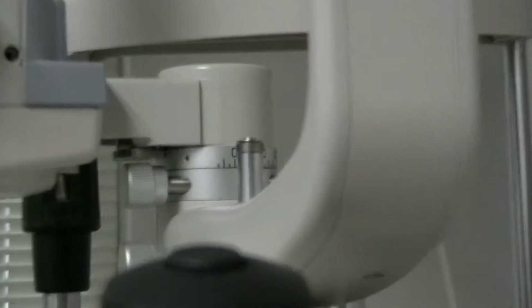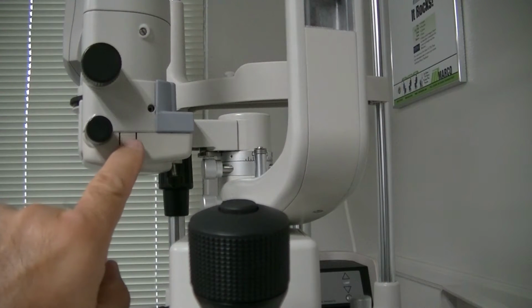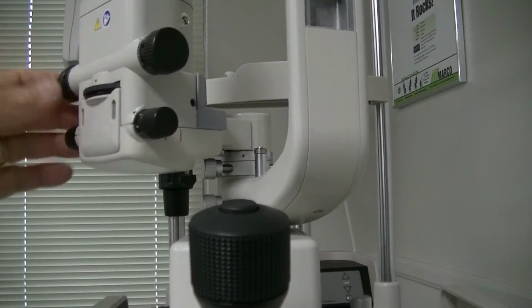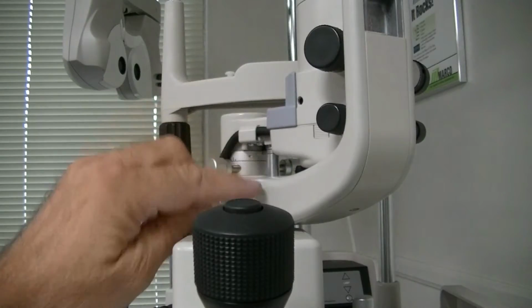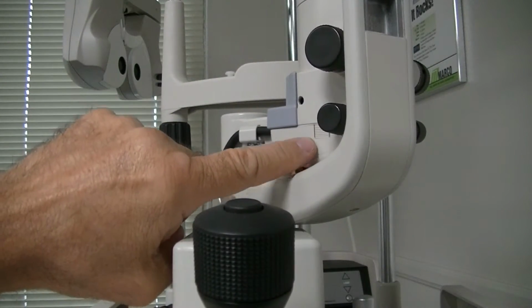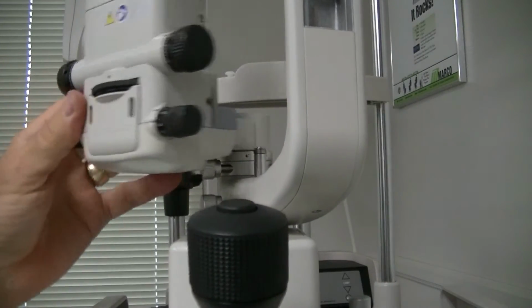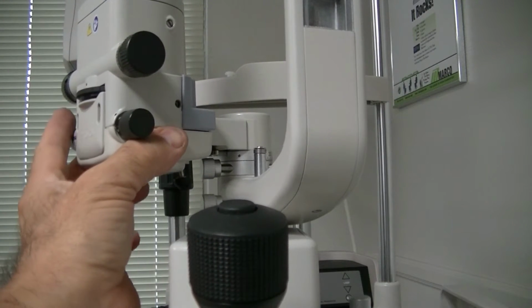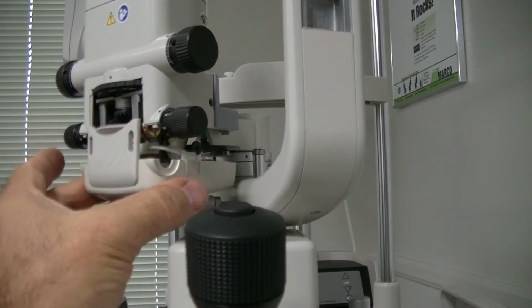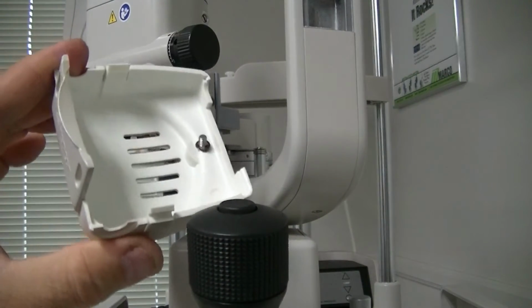Now, when you have that loose like that, if you look, there's a little C-shaped tab here on this side, and I can get it up over that edge. There's a little C-shaped tab on this side, right there. So what you want to do is grab both those tabs with your finger and your thumb, and squeeze them together, and then this whole thing will come right off like this. Once it's off, set it aside.